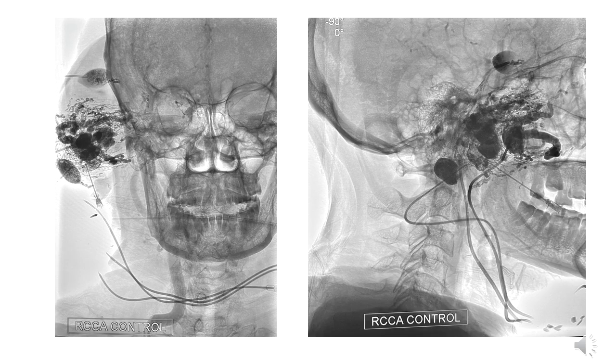Of the glue cast, we can see some of the contrast blobs as well as a lot of glue. You can see here that the glue has further migrated in the small vessels, which I have noticed in some of the cases. The longer the procedure goes, even after embolization, we feel that the glue has solidified, but I have noticed in some cases that they keep migrating into the smaller vessels even after you have closed the injection. So we can see nicely some of the needles which are still there.